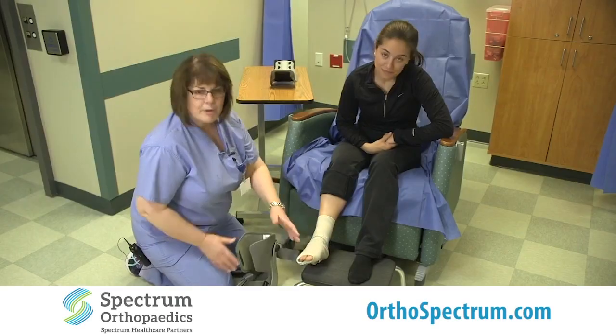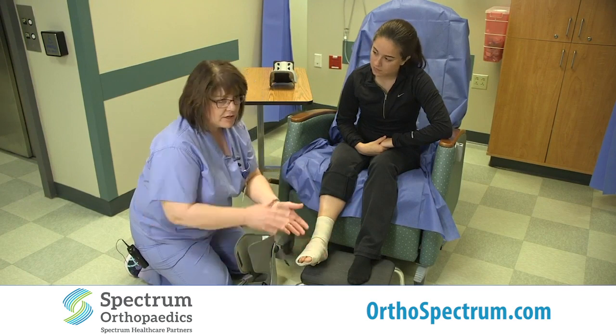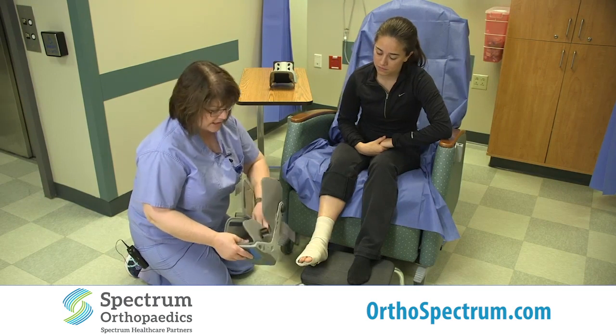After you have your first follow-up appointment, they will take down the dressing and you will likely have a much smaller bandage on your foot. At that point, you'll likely still be using the boot.